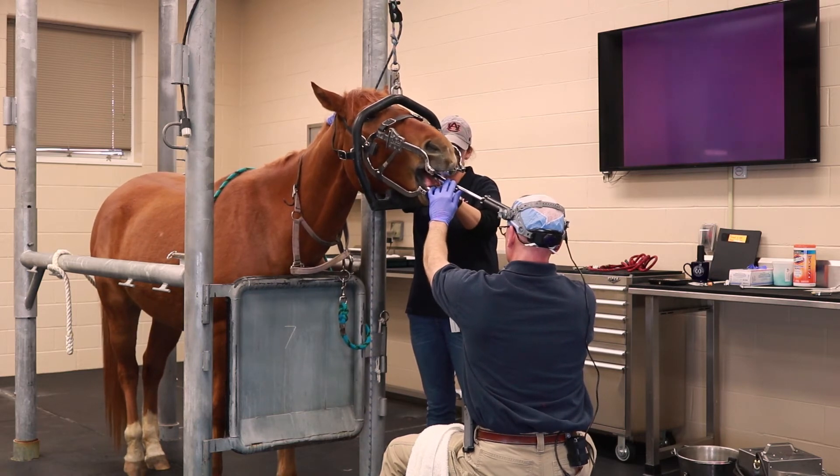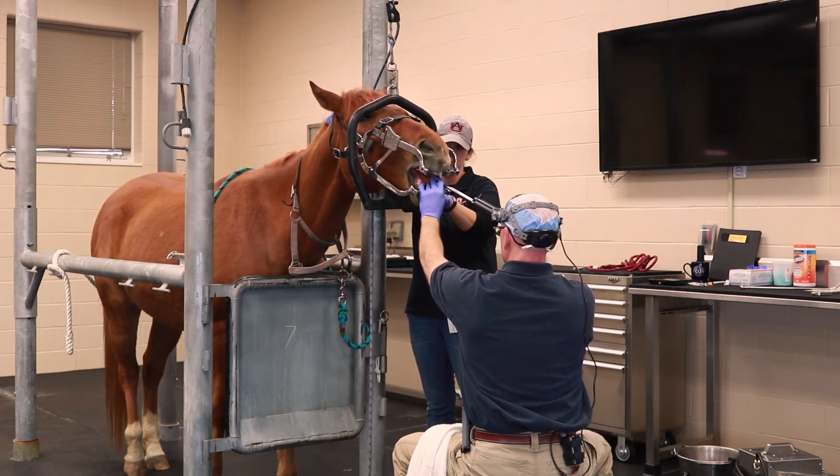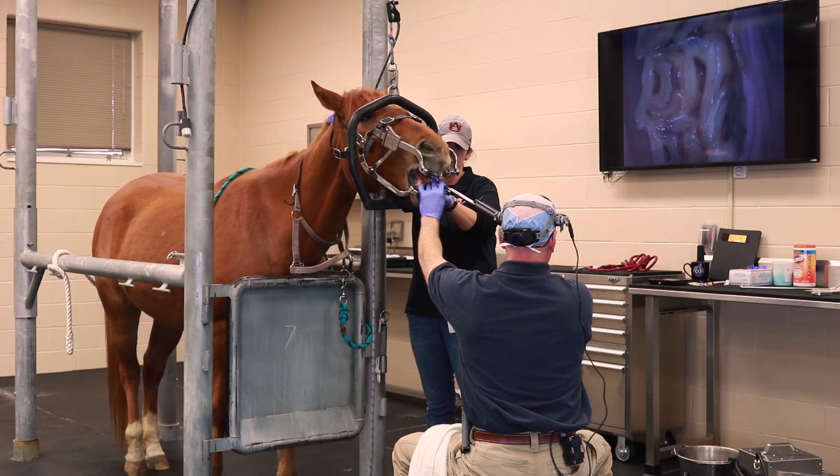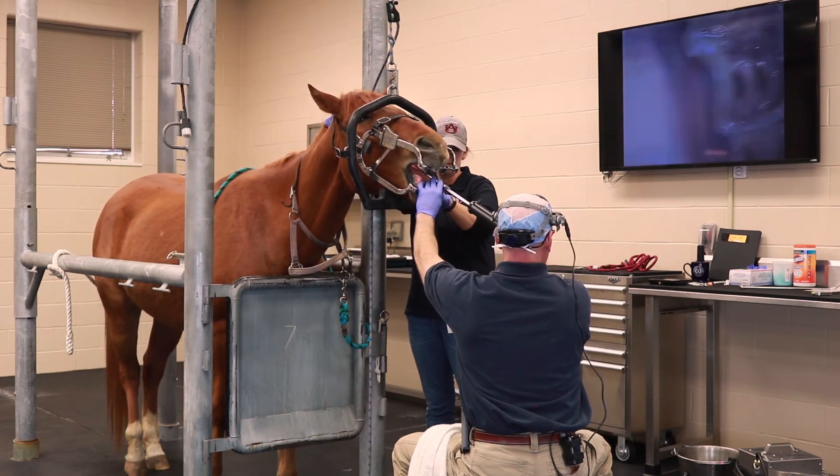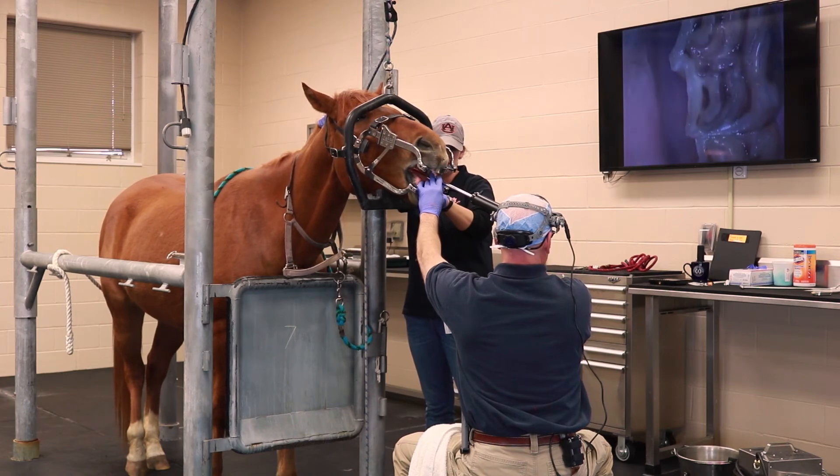Additionally, it allows the clients to be involved with the examination as well. They get to see what we're seeing. It makes it much easier for us to explain to them what our findings are, what our recommendations are, and what we're going to be doing in the horse's mouth to get problems corrected.